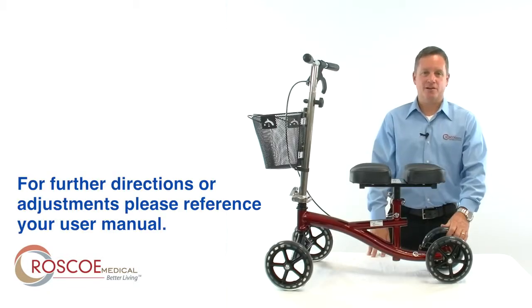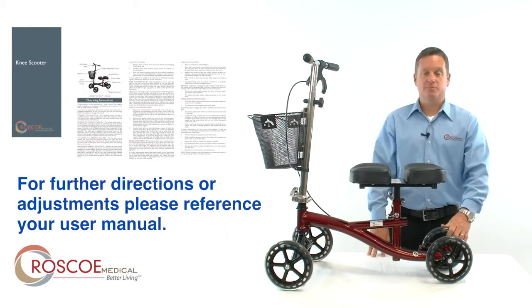This concludes the assembly of your Roscoe Knee Scooter. For further directions or adjustments, please refer to your user manual.